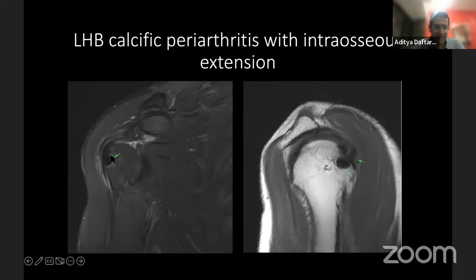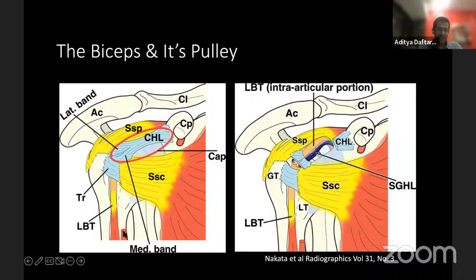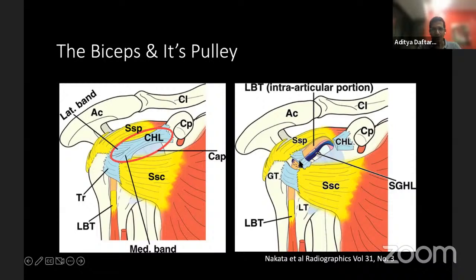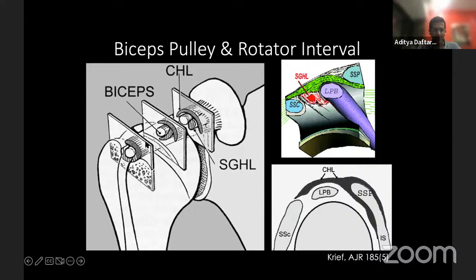Here's another example of biceps calcific periarthritis, and in this case you can also see calcific periarthritis extending into the bone — an unusual presentation at enthesial attachments. As the biceps goes vertically up, it crosses and becomes horizontal through a pulley. That pulley is formed by the coracohumeral ligament and the superior glenohumeral ligament complex. The superior glenohumeral ligament encases the biceps, with the coracohumeral ligament superiorly and the superior glenohumeral ligament running anterior and inferior to it.